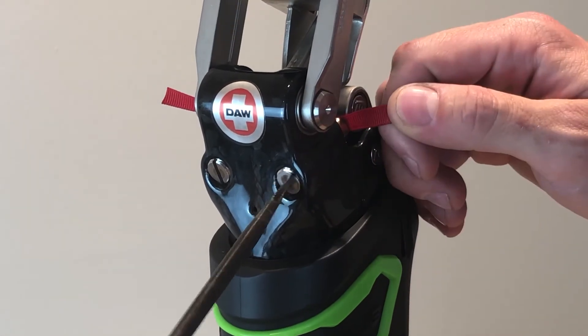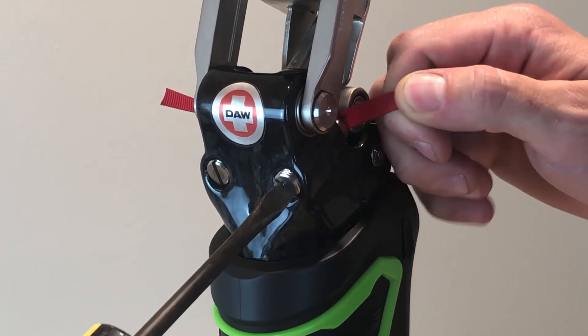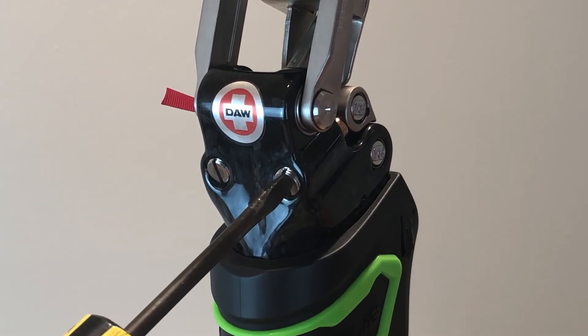To provide maximum stance flexion angle, loosen each screw one at a time until the red tabs pull out easily. Then screw back in 3 quarters of a turn.